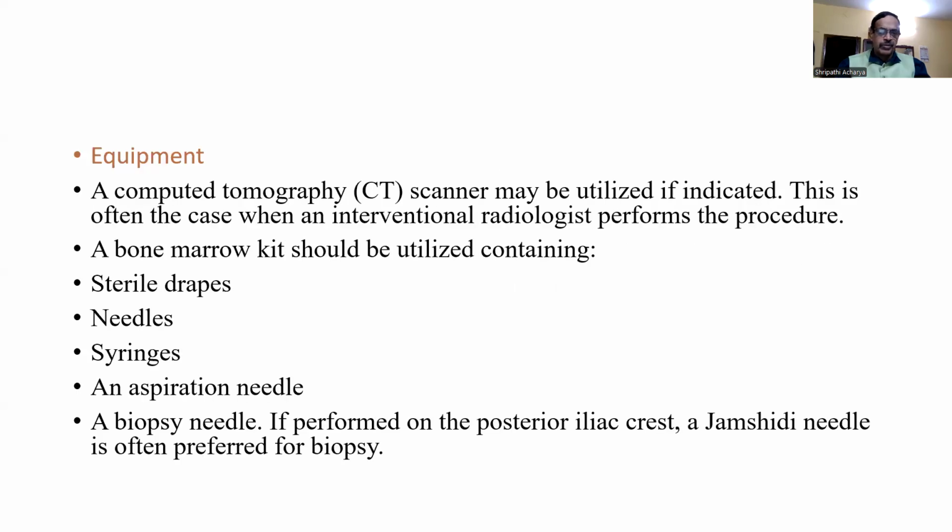Equipment. A computed tomography scanner may be utilized if indicated. This is often the case when an interventional radiologist performs the procedure. A bone marrow kit should be utilized containing sterile drapes, needles, syringes, an aspiration needle, and a biopsy needle.